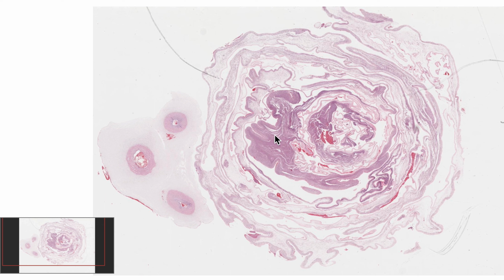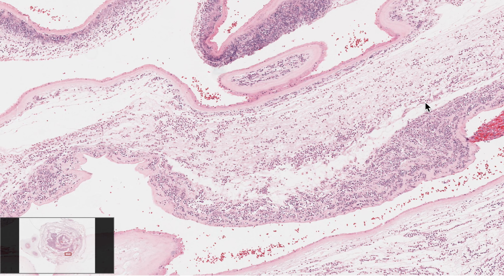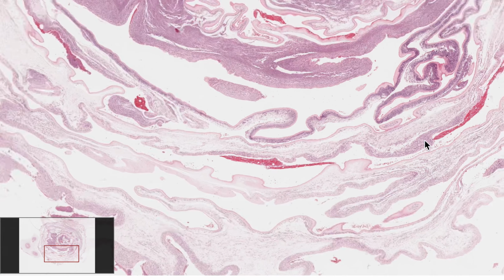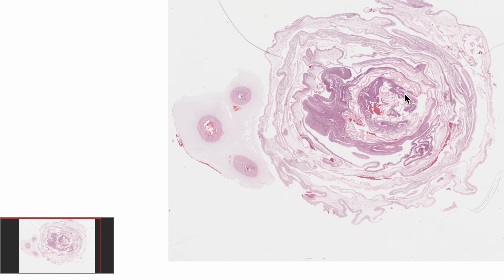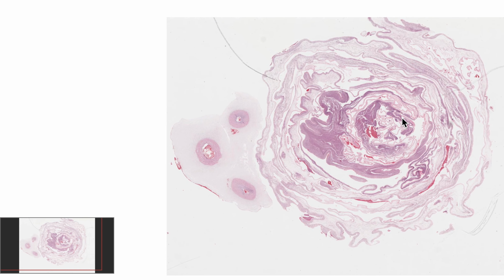And you should have no neutrophils in either the chorion layer or the amnion layer. So this is acute chorioamnionitis. Really bad acute chorioamnionitis. And this is the mom's response to infection. So these neutrophils are from mom.